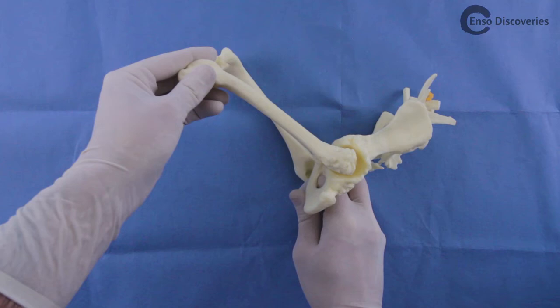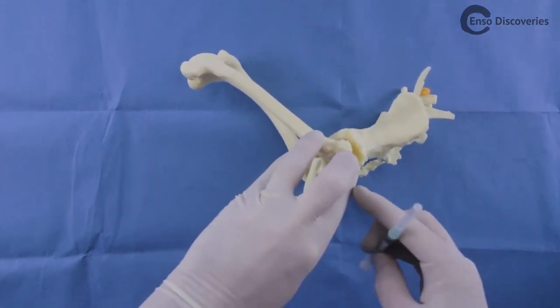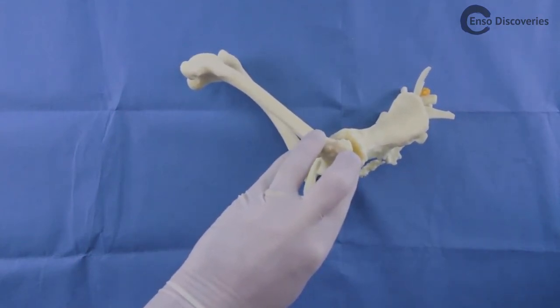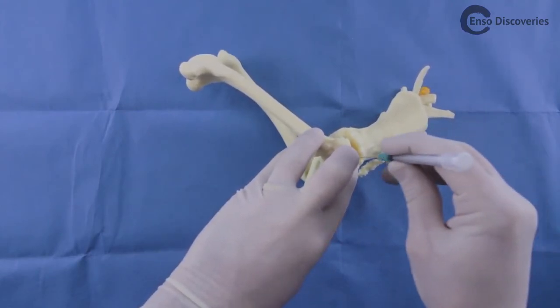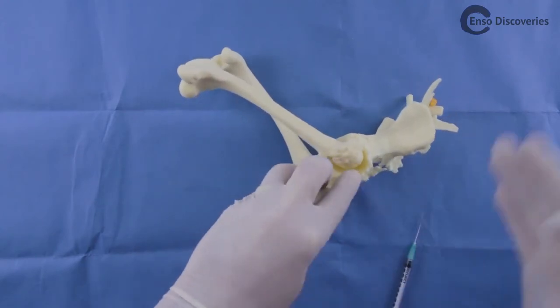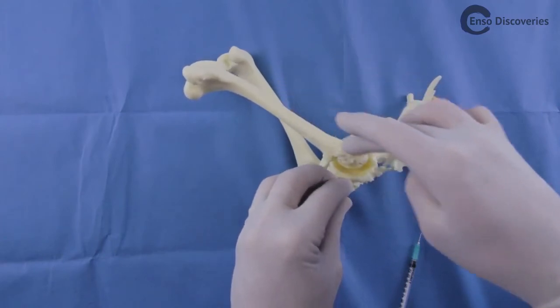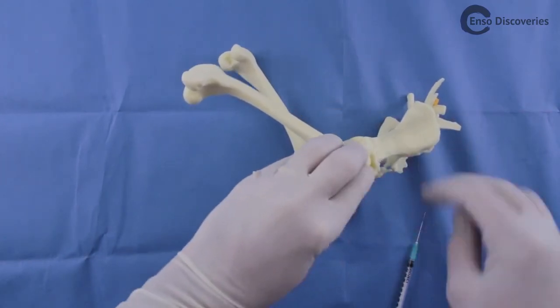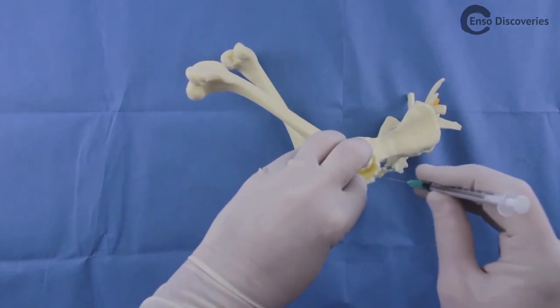With your index finger off the end of the greater trochanter, insert your needle around the middle of your index fingernail. Take care not to poke your glove with the needle. The needle should be inserted perpendicular to the skin and in line with the greater trochanter — as you can see, the trochanter points directly towards the hip joint. The needle should be inserted in one smooth continuous motion; avoid jerky stop-and-go motions.